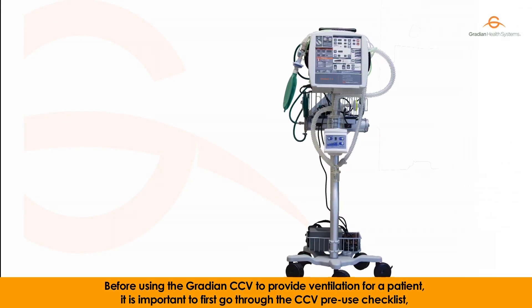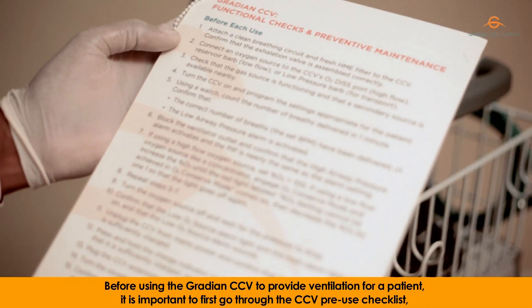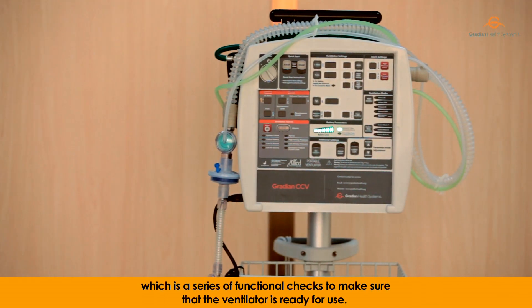Before using the Gradient CCV to provide ventilation for a patient, it is important to first go through the CCV Pre-use Checklist, which is a series of functional checks to make sure that the ventilator is ready for use.